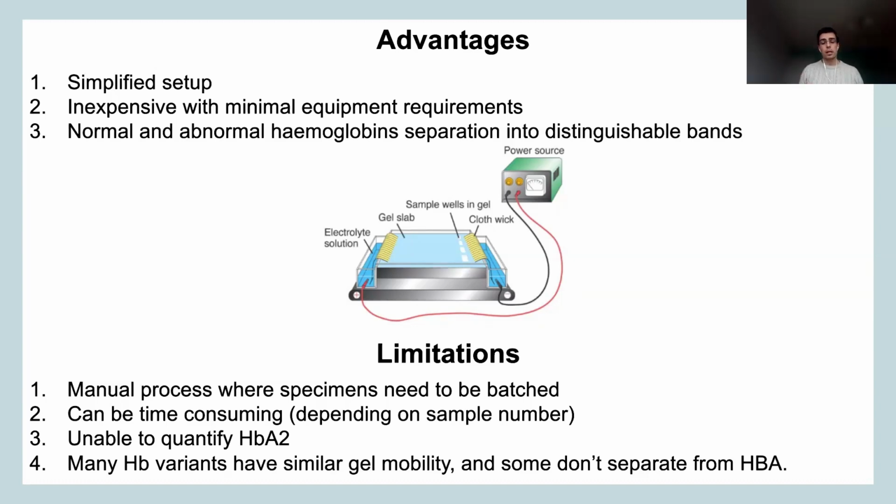And this technique, as I said before, even if coupled with other ways to measure the intensity of the bands, is not a reliable way to give an accurate estimation of how much the hemoglobin A2 will be. Definitely not for diagnostic purposes. Being, again, a more simplistic technique, and because the runtime is not that long as well, there are more than 1,300 hemoglobin variants described.